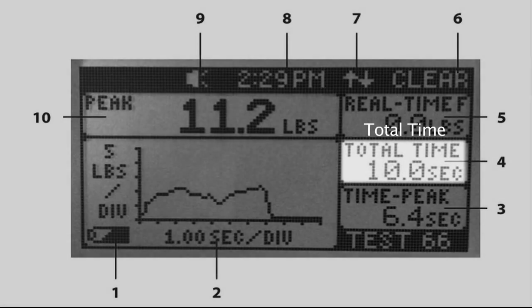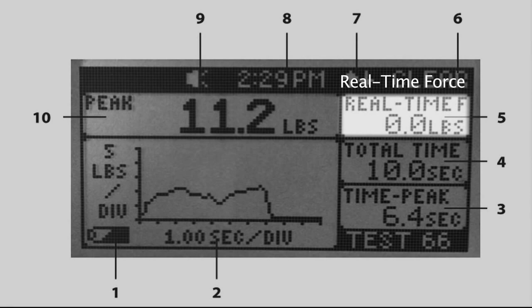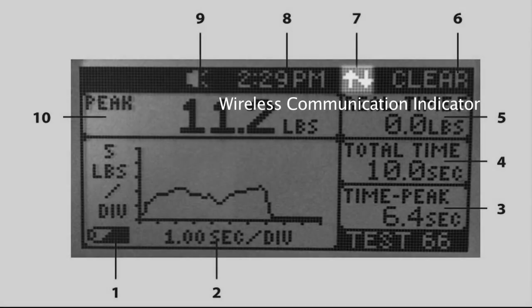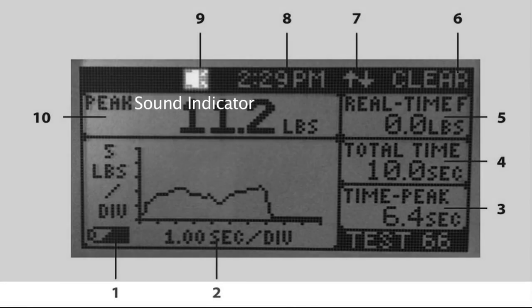Item four is total time — the total duration of the test in seconds. Item five is real-time force, which displays the force being measured during the test. Item six is the clear top button function, which shows the current function for the top button. Item seven is the wireless communication indicator, which shows when the wireless device is attempting to connect or is connected. Item eight is the time display, which can be set manually or synced with a PC in the options menu. Item nine is the sound indicator, which shows whether the beeper is on or off for the current test.